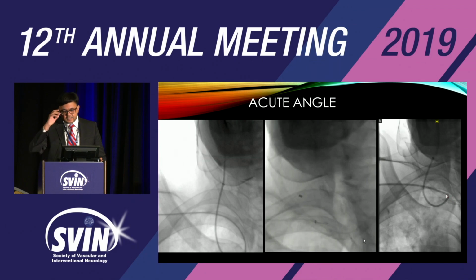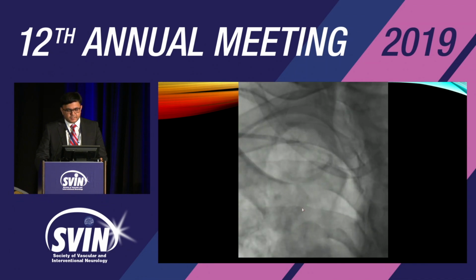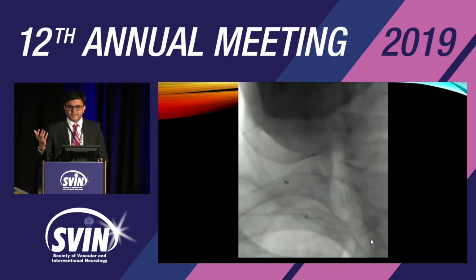In the carotid artery, I will advise using a short, like 80 centimeter sheath. And if you're having trouble, some resistance, think about a kink in the catheter. So in this case, I removed the micro wire. It was damaged. Then I'm pulling back to straighten the system a little bit. Let's see, my catheter is down, and this was more than luck. I just pushed the Navien all the way up into the distal common.